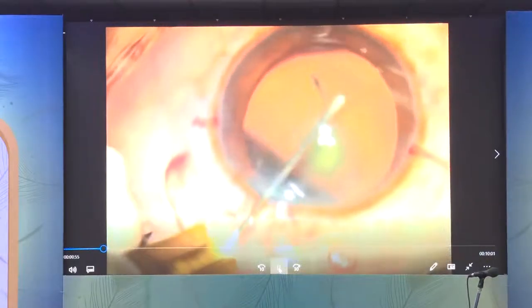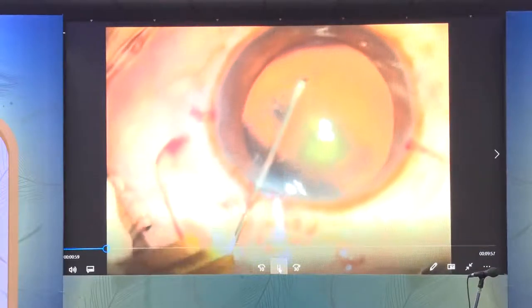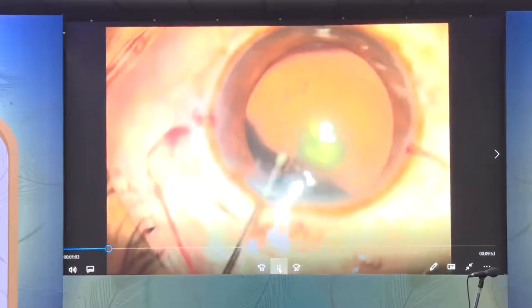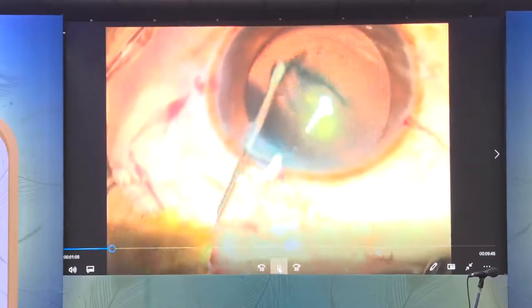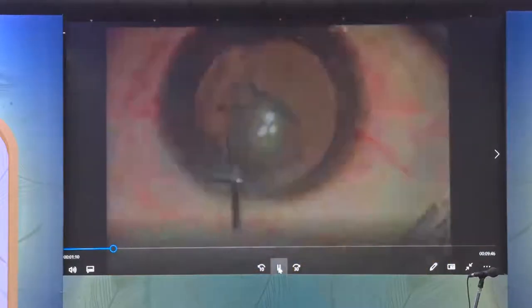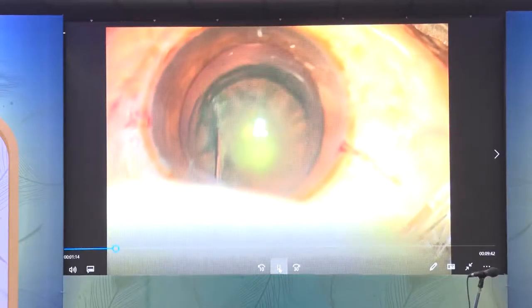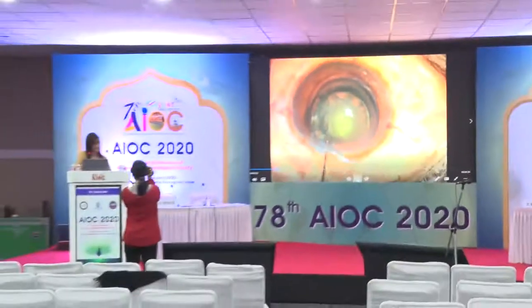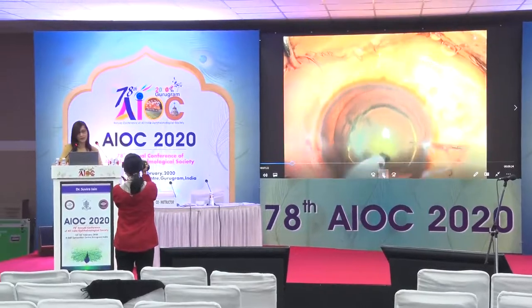The capsulorhexis needs to be well-centered and approximately 5 millimeters in size — adequate enough to allow ease of nuclear emulsification, yet small enough to allow placement of a sulcus IOL if required. The crucial step is hydro-delineation, which creates the endonucleus that is subsequently emulsified, but also creates the epinuclear barrier which supports the posterior capsule.